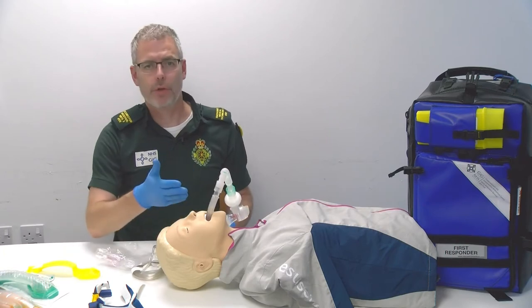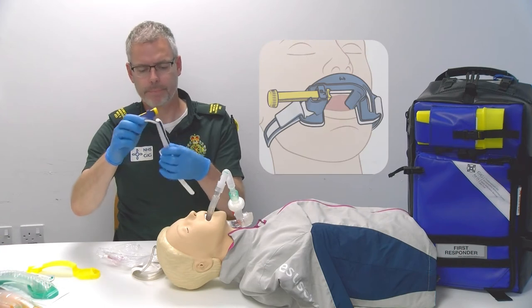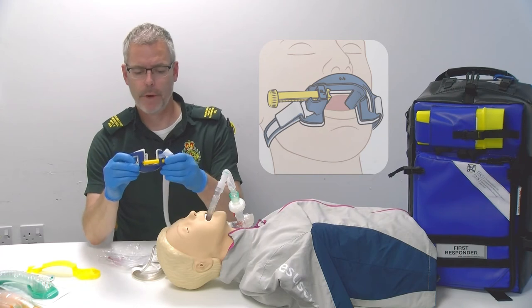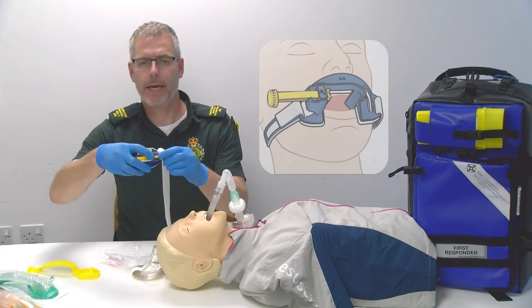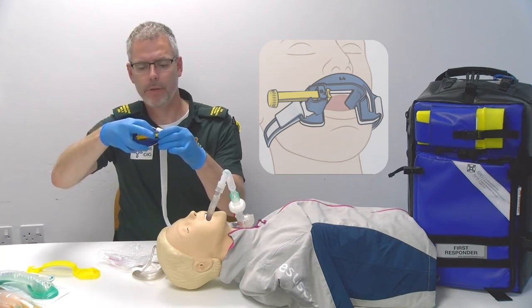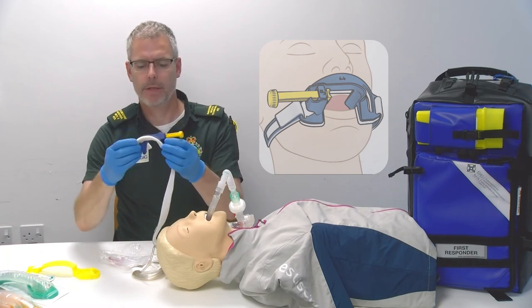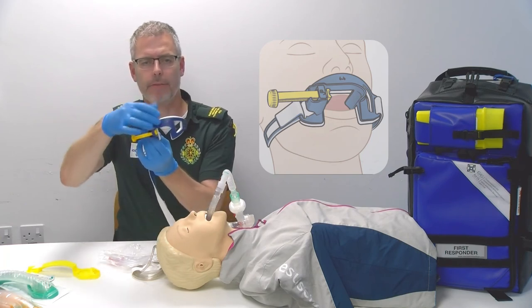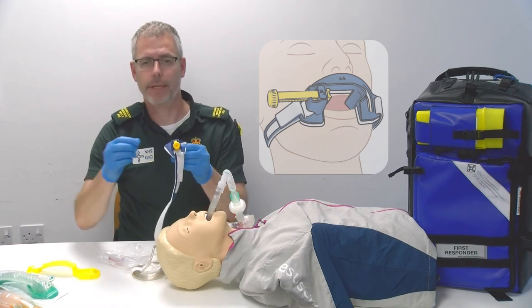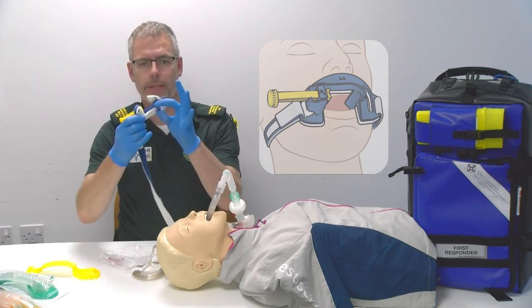Now I need to secure the iGel. For this I'm going to use the Thomas clamp. Looking at the Thomas clamp you have a white locking device and a locking tab. If you press the tab at the top you can pull the yellow locking bar away quickly. On the top side of the clamp there is a symbol of a nose which gives you the indication that that needs to be closest to the patient's nose, and there is an additional bite block as part of the clamp itself.